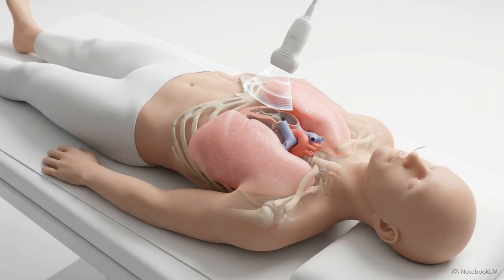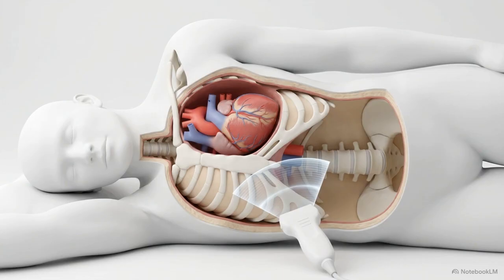If air in the lungs obscures your image, roll the patient onto their left side. This left lateral decubitus position physically drops the heart away from the sternum and closer to your probe.